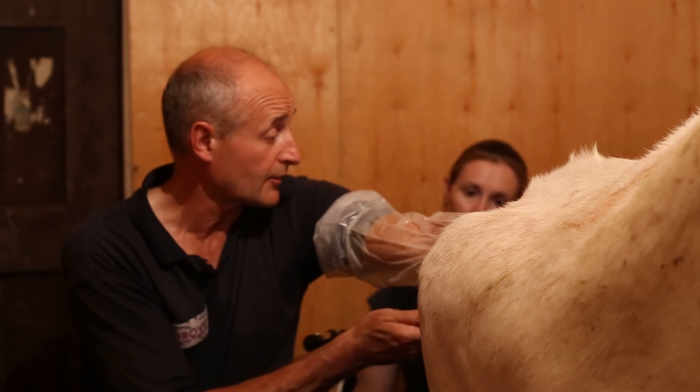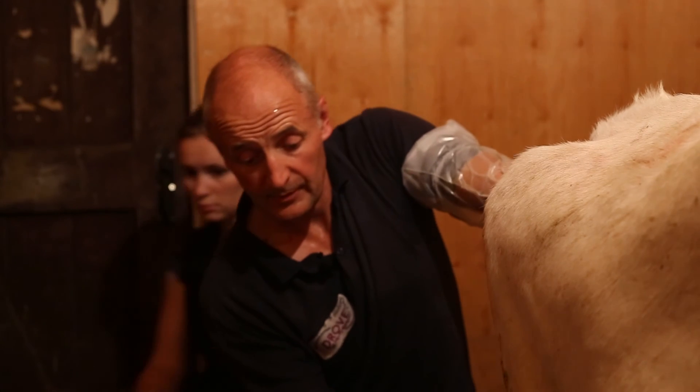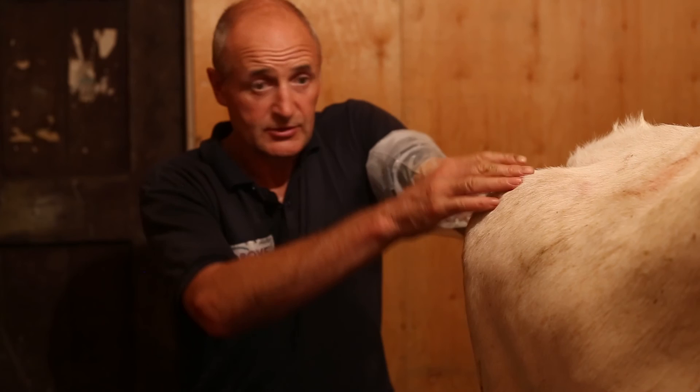We take the probe out and I just shimmy over to the lab and get a polystyrene box which is preheated. We take the fluid over there straight away and search for the oocytes.